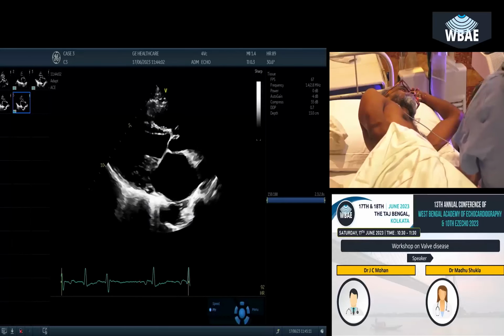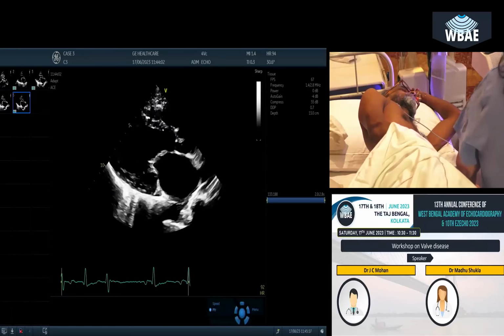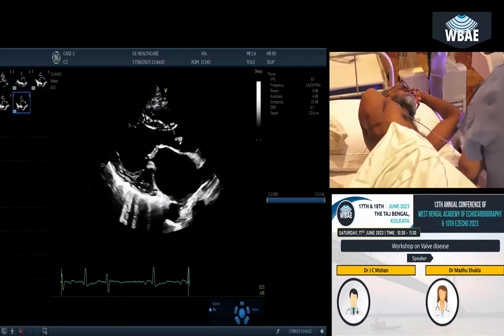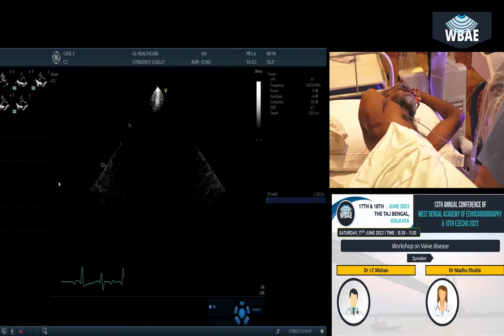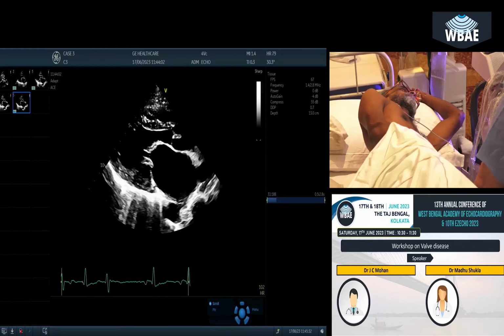Now the left ventricle seems to be dilated. Doctor, you want to go ahead with this measurement? You can do that actually. So Dr. Madhu, just show the measurements of left ventricle and left atrium, before we put any color or anything. So I think we are doing some chamber quantification in the LV and the LA. I think we will do LV, LA and RV. And the only suggestion is that please let's not use M mode for the assessment of LV sizes and LA sizes.